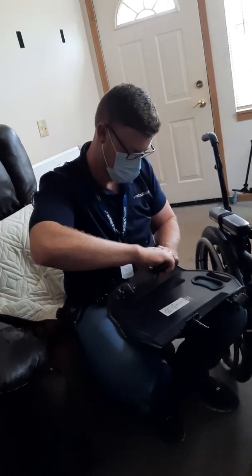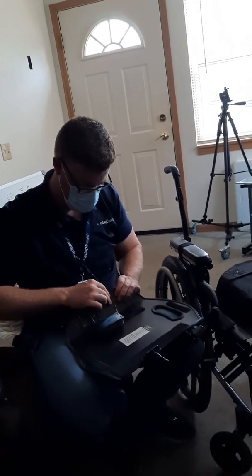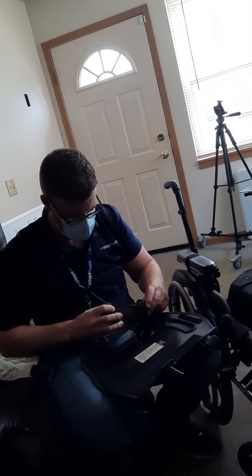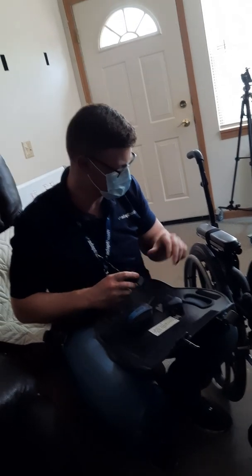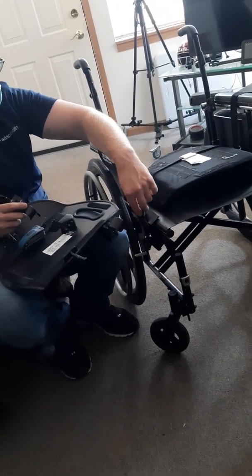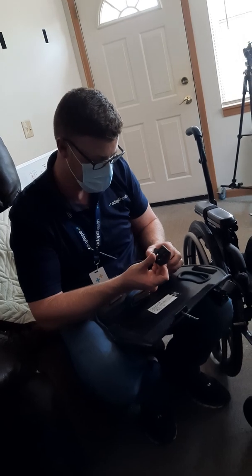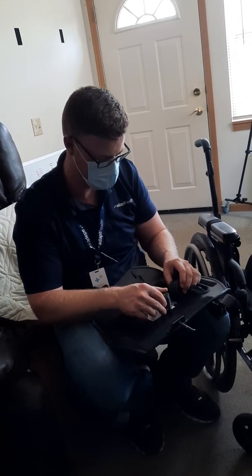I'm just going to start asking you questions and you can talk about it. That sounds perfect. What are some of the common problems that, in your history of dealing with wheelchair repair, you've seen with wheelchairs like that and electric wheelchairs? With wheelchairs like this, a lot of times what fails is stuff in the front, these casters up here and the forks. That's the biggest one, and then probably the brakes would be next. The reason is they move the most and take the most abuse, because you have to constantly put on your brakes, and you have to do it quickly. Exactly. The parts that have to move around the most are the ones that get the most abuse, and those are the ones that end up failing.